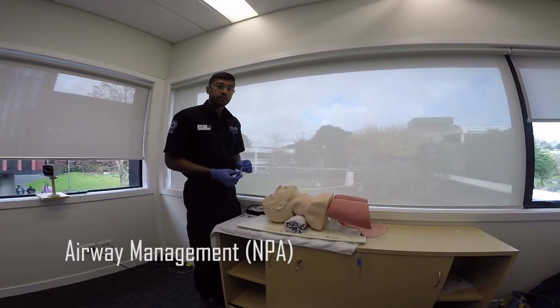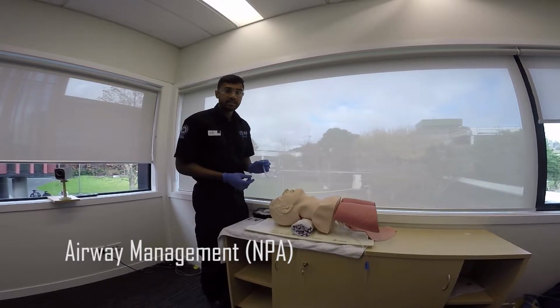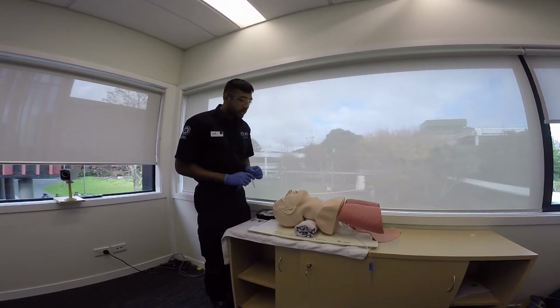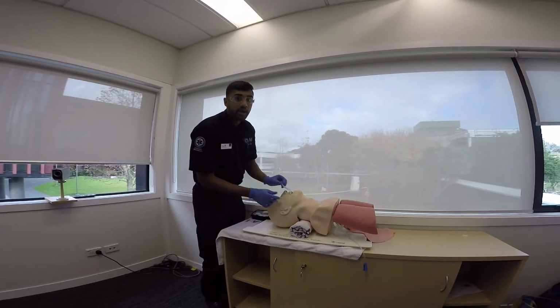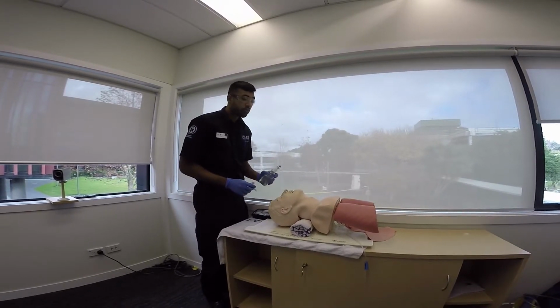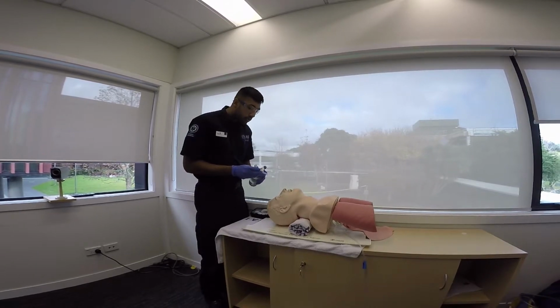Another airway adjunct we can use is an NPA, which stands for nasopharyngeal airway. To measure it, you want to measure it from the nostril to the corner of the mandible, and before inserting it, you want to lubricate it with a water-based lubricant like so.